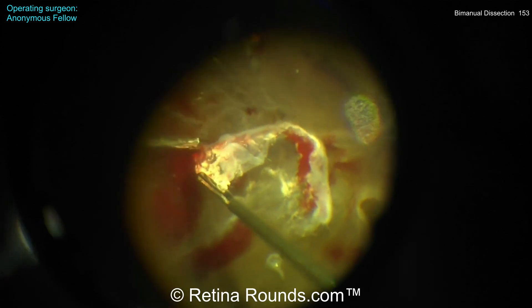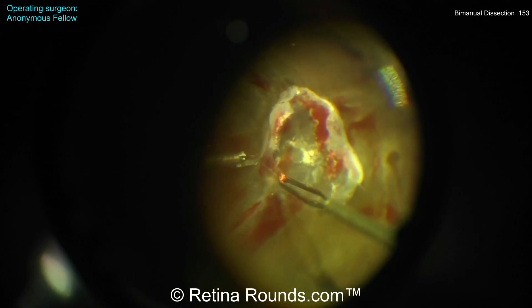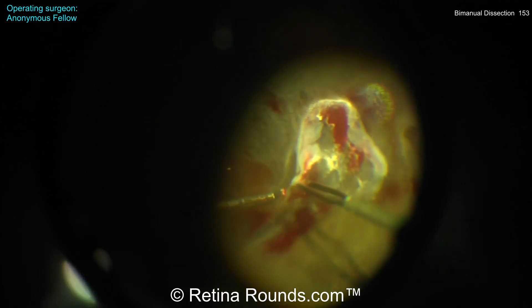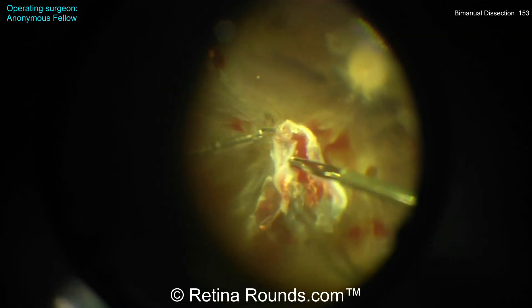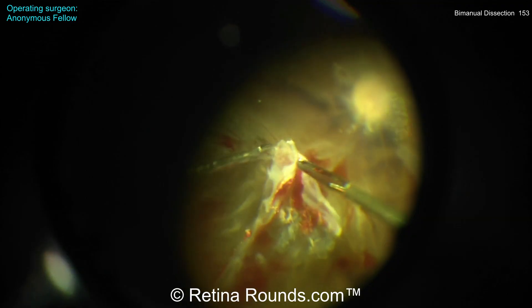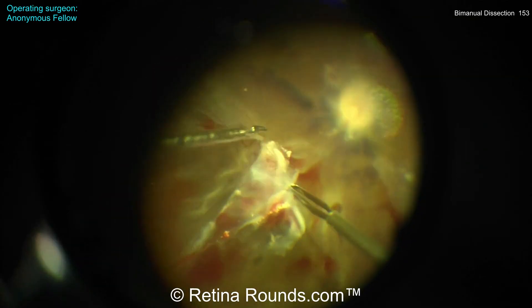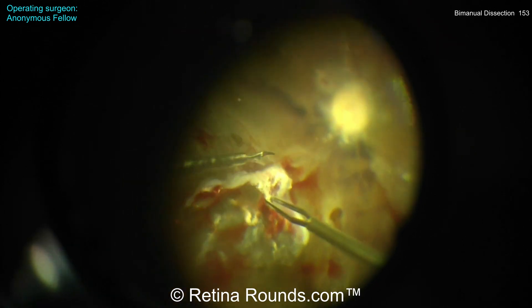Now you can see that's more of a temporal-to-nasal pulling, revealing the interface between the membrane and the underlying retina. That's going to be a safer approach. You see the left hand — the angle that scissor is going in — it wants to go in a temporal-to-nasal direction. This is a far more efficient way of dissecting. I'd like to see that membrane being pulled back a little bit more during this process. That's much better — you can see that interface there.